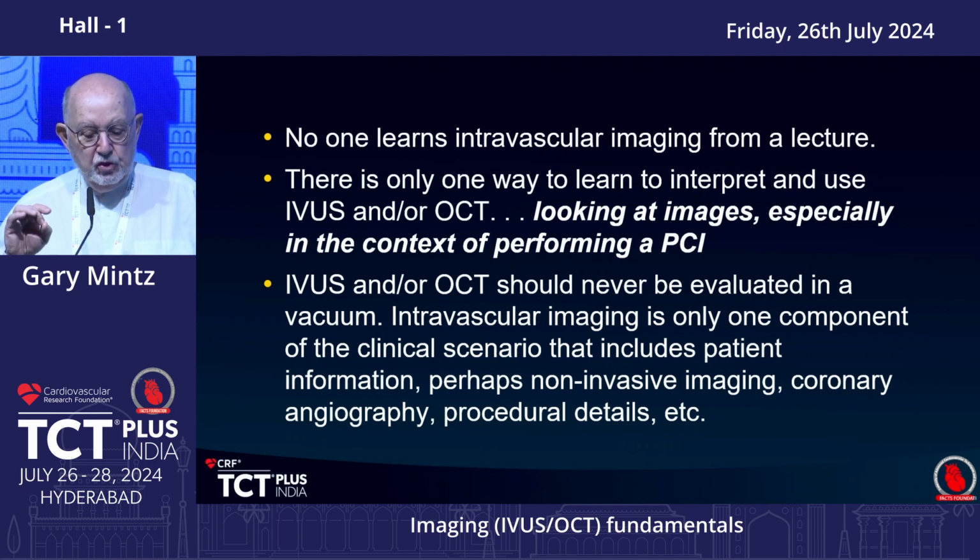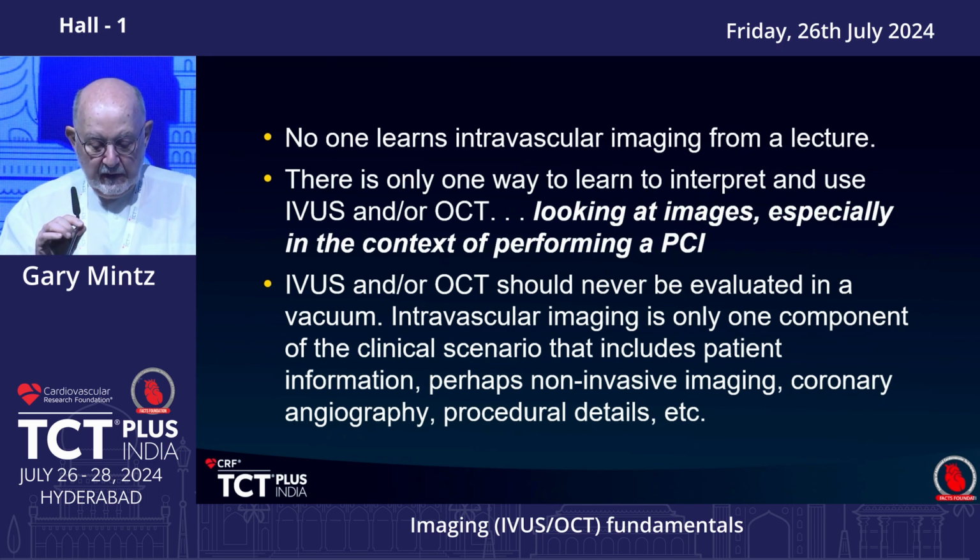IVUS or OCT should never be evaluated in a vacuum. It is only one component of the clinical scenario that includes patient information, non-invasive information, coronary angiography, procedure characteristics, and so on.